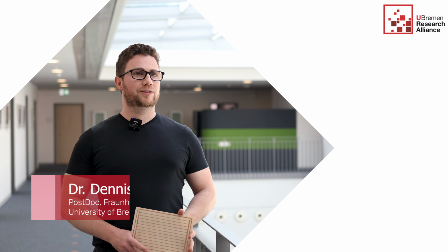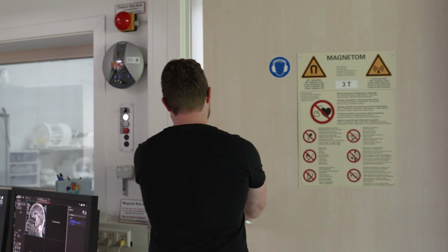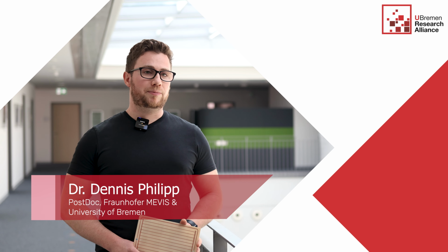We want to introduce new degrees of freedom into magnetic resonance imaging. That means we want to be able to make the imaging faster, more reliable, higher contrast, higher resolution, or we want to enhance patient comfort. A specific problem is medical imaging of small children, which you have to convince to remain motionless inside an MRI scanner for maybe 30 minutes.